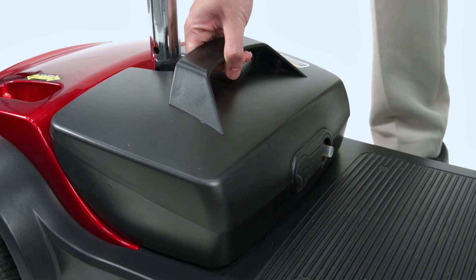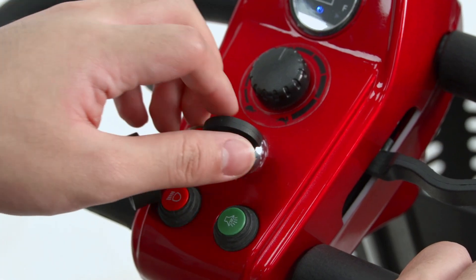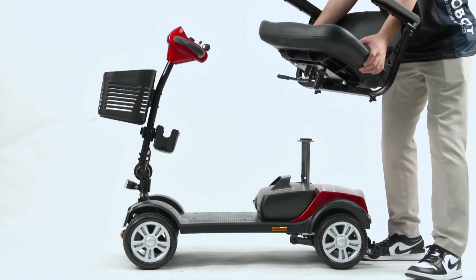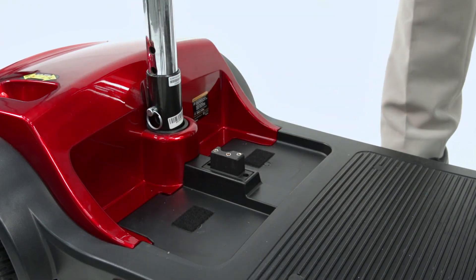When not in use, store the battery away in a dry area away from direct sunlight. How to remove the battery: First, turn off the device and remove the key. Pull up the seat to detach it from the body. There is a handle on the battery — hold onto it and pull it up to remove the battery.